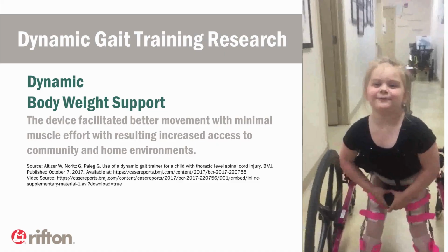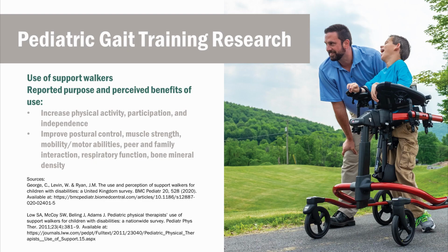Thank you. This brings us to further research on pediatric gait training. Although this does not differentiate between dynamic versus static gait trainers, it does give us information about the use of gait trainers for this population.